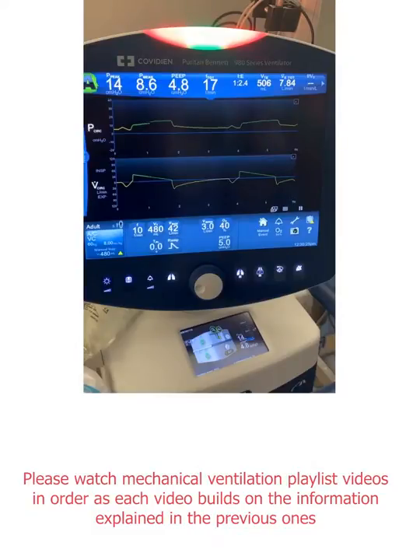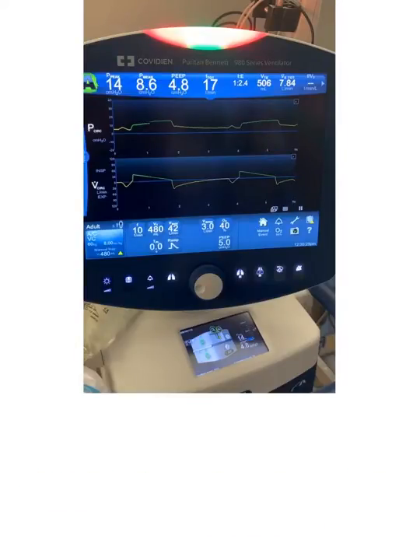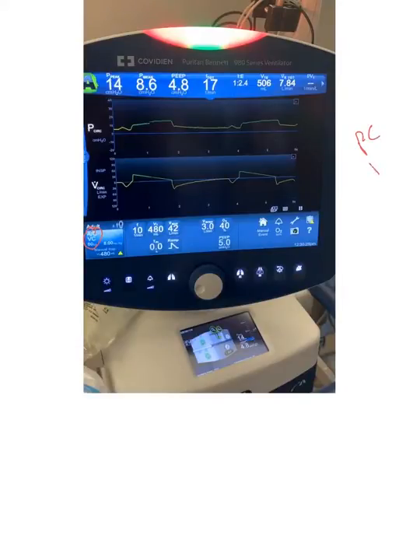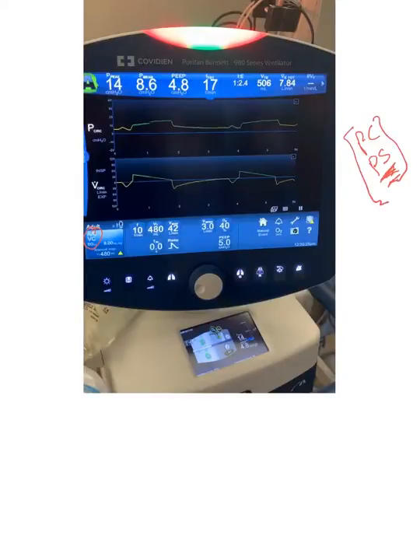Let's demonstrate peak inspiratory pressure on the ventilator. As you can see, this is a volume control mode of ventilation, and this is where we have the issue with peak inspiratory pressure. With pressure control and pressure support mode of ventilation, the target is pressure and the pressure is constant.